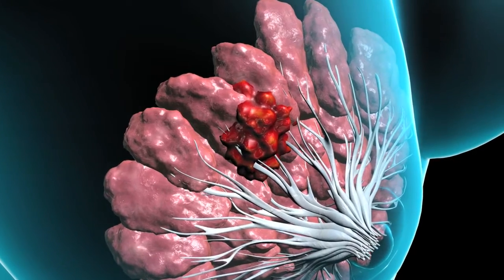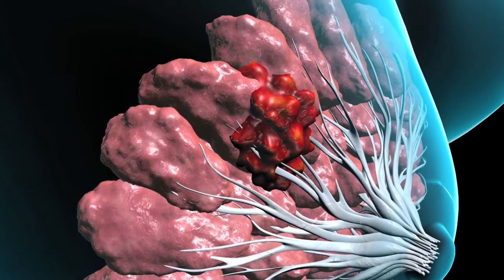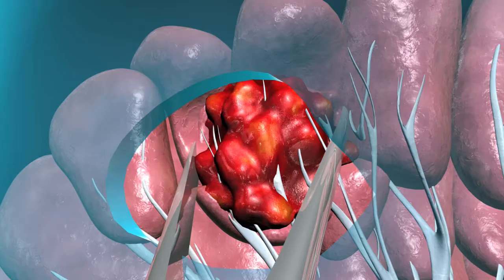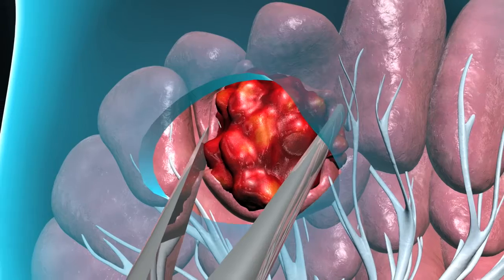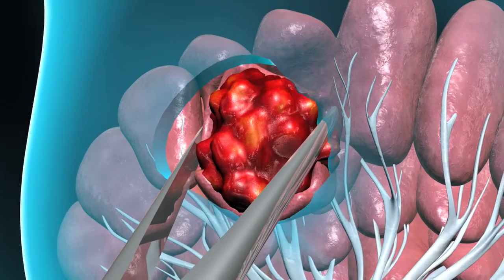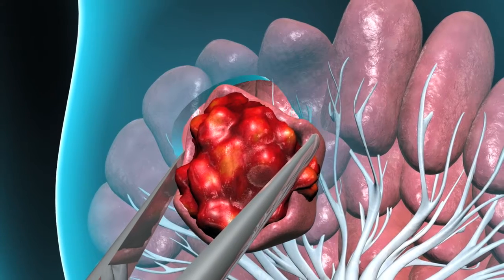Even if your breast lump can be felt, your physician may recommend removing the entire lump rather than sampling it with a needle. Your surgeon will make an incision in the breast and remove the entire mass. Surgeons will often also remove a small amount of healthy tissue surrounding the mass during these procedures.